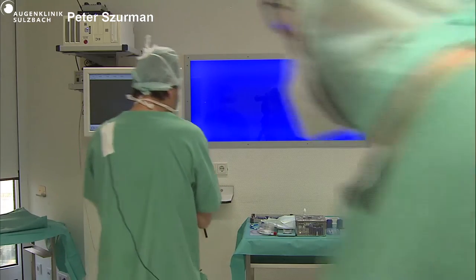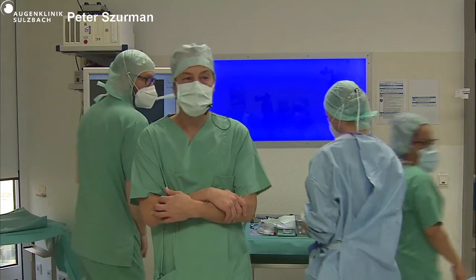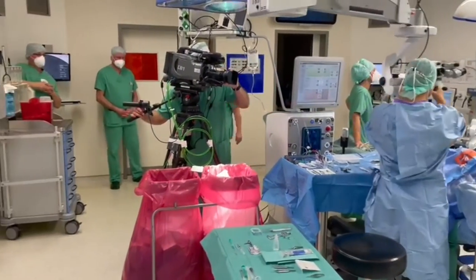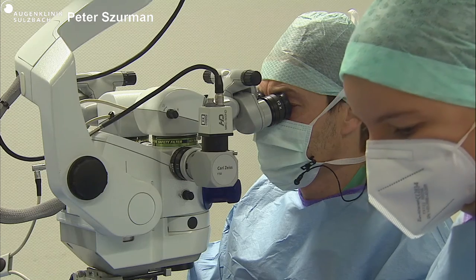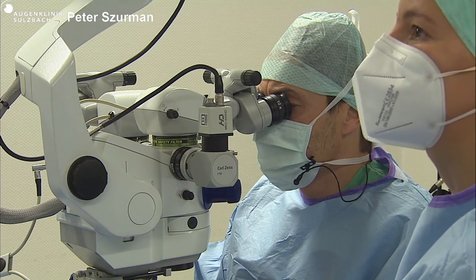Pass, Claudio is going to take. So very, very elegant case, Claudio. Tell us your approach. She doesn't have any membranes. We had an OCT a few months ago. She doesn't have any membranes. There's a little bit of fluid in the fovea, and let's start.